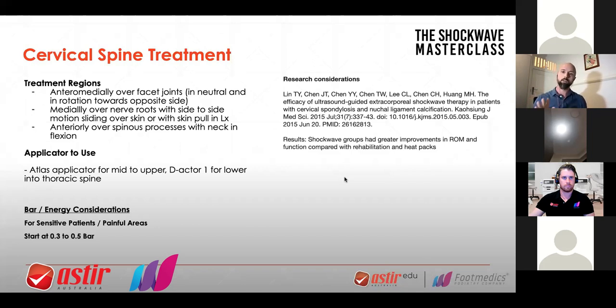Start with a low intensity — three to five bar over the segment using the Atlas applicator. I've indicated here an anteromedial direction over the facet joints. So from that facet joint, where the point of pain is, from the back, pushing it with the shockwave that way, and a bit medially — going in on a slight angle. That will glide the joint away. If you want to get a bit more intense, you get them to turn away from that direction of pain — that left side rotation — and you get the applicator on there with the rotation, and then apply the applicator.